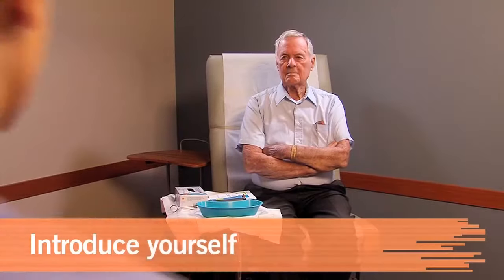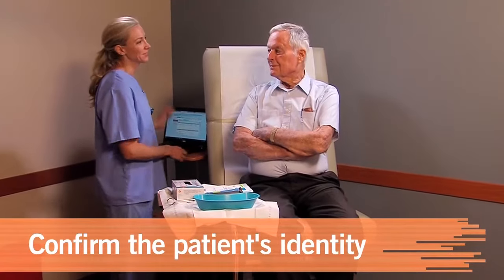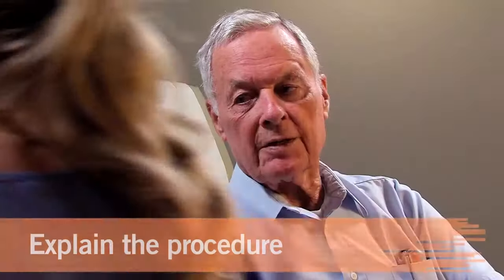The solution should be kept at body temperature to help loosen the cerumen. Before you begin, introduce yourself to the patient. Be sure to use two identifiers. Then explain the procedure: today we're going to be performing an ear irrigation. I'm going to use this device and squeeze a special solution into your ear to flush out the earwax. Do you have any questions about the procedure?